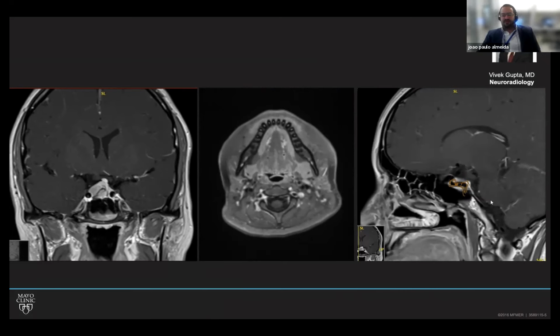So when we look at those segments and try to understand the relationship with this tumor, we see there is some hyperintense signal here, here, and even here. But this one here, I know this is the dura, so we would have to explore above and below. It doesn't mean there is tumor in the cavernous sinus. When you look just at this cut, it can be just ballooning and pushing the medial wall of the cavernous sinus laterally. But anyway, it requires assessment so one can try to maximize the resection in this area.